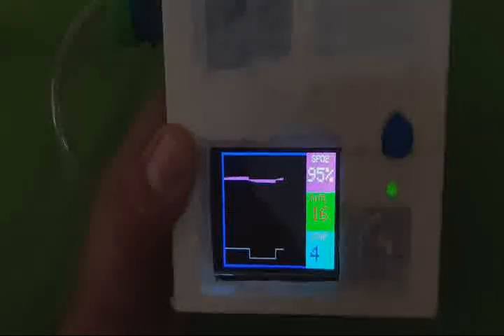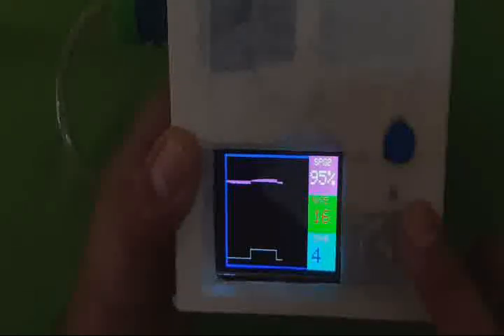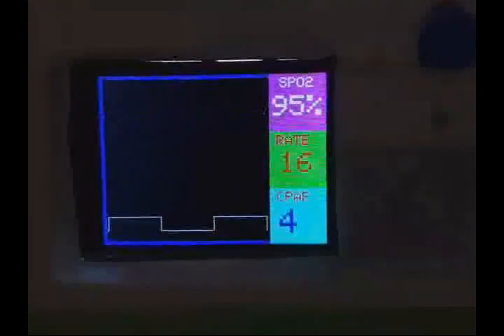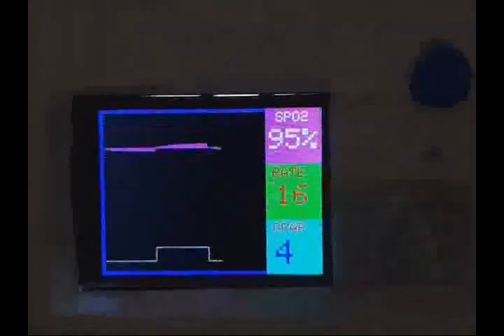And another is the CPAP. I already informed you that the CPAP and the PEEP are two types of mode. I have one button here, and one LED is continuously cycling here. I'm going to explain how this CPAP and PEEP mode works in my machine.